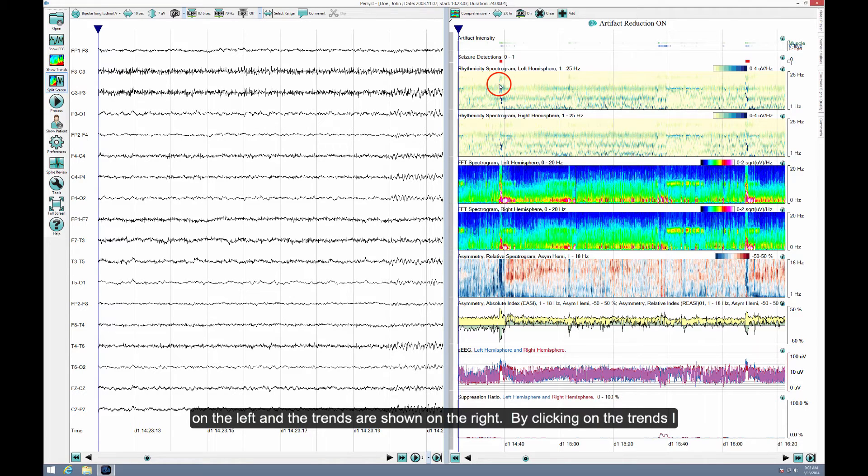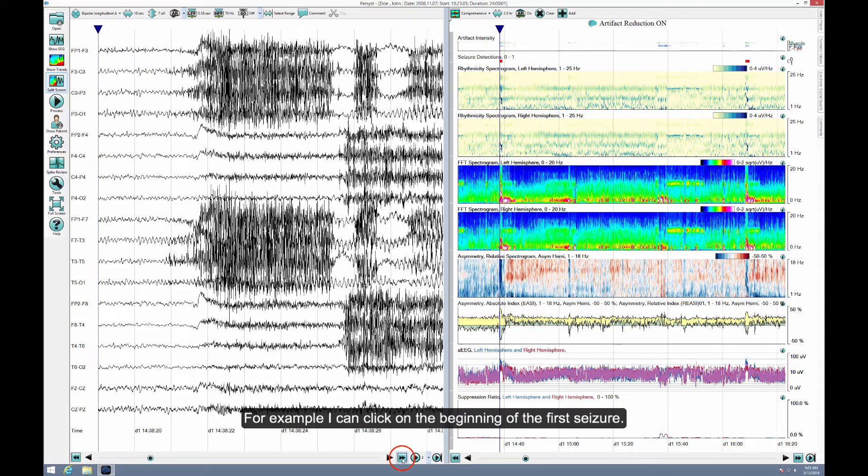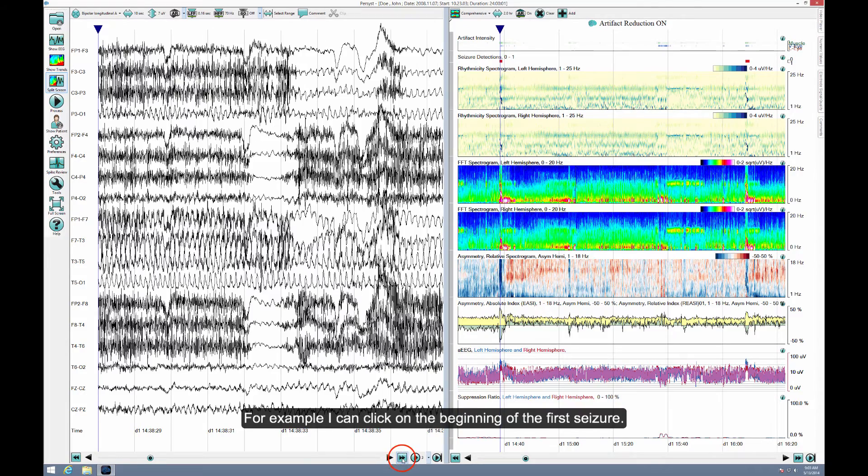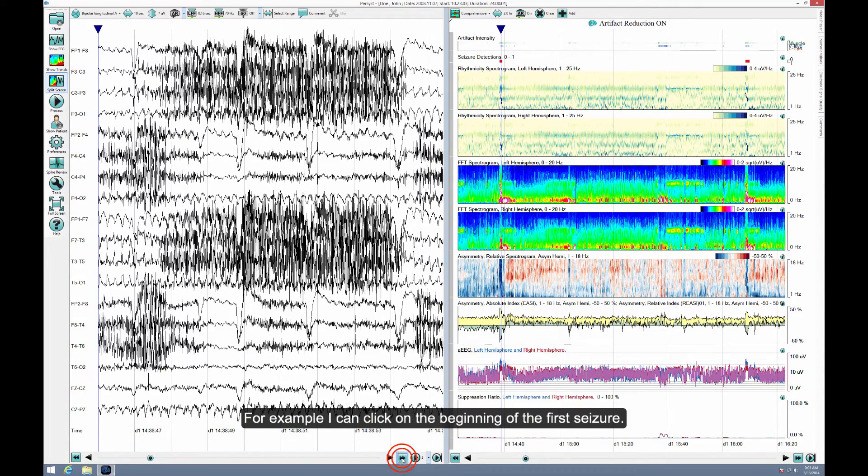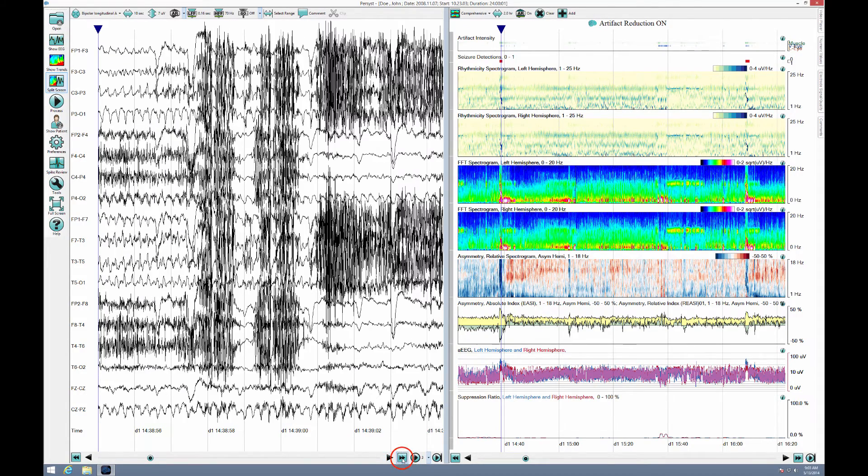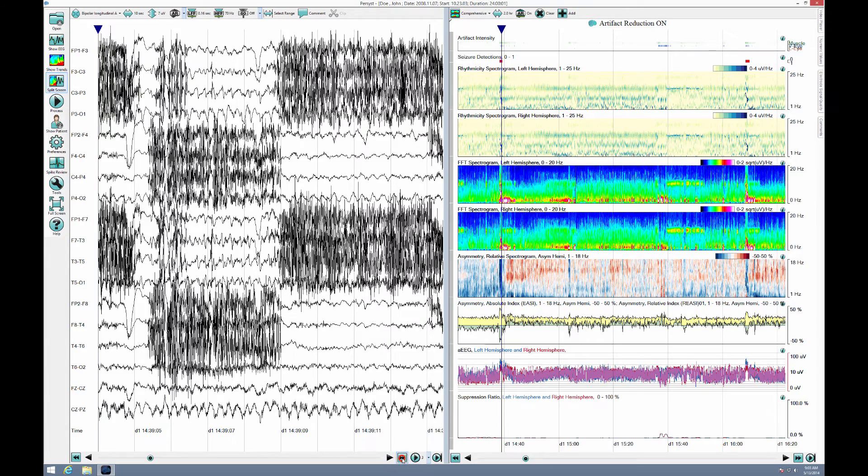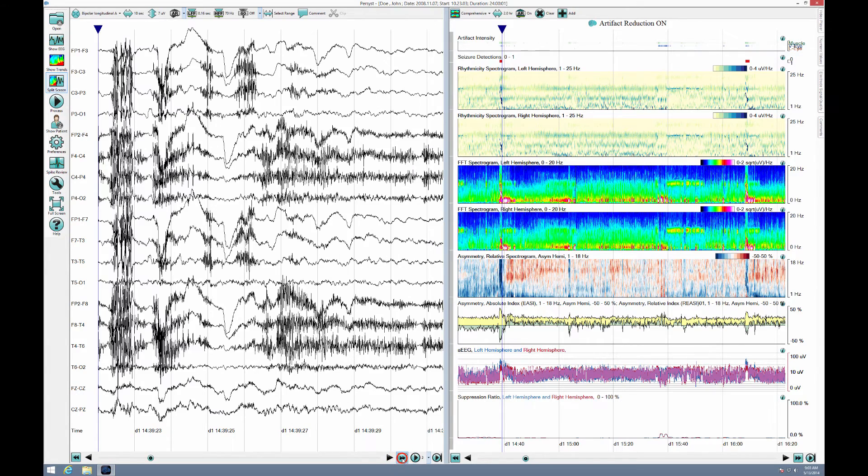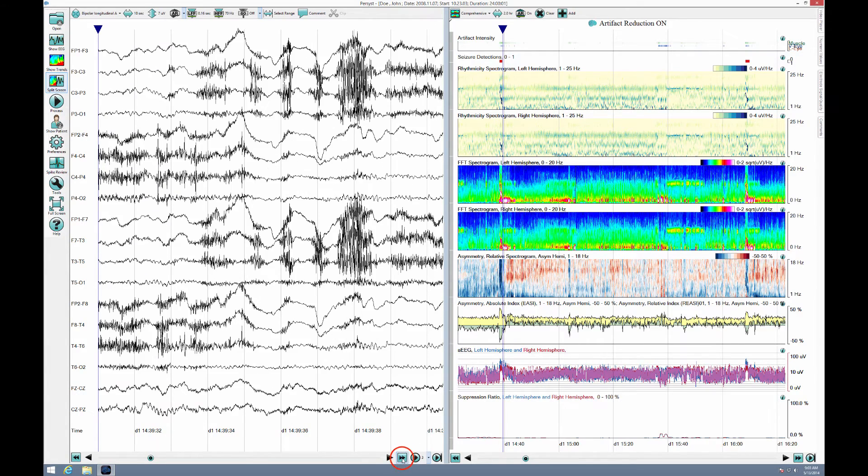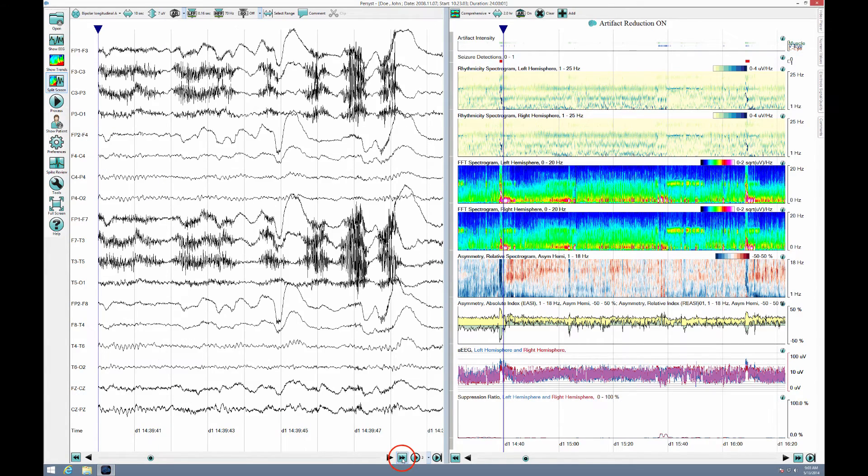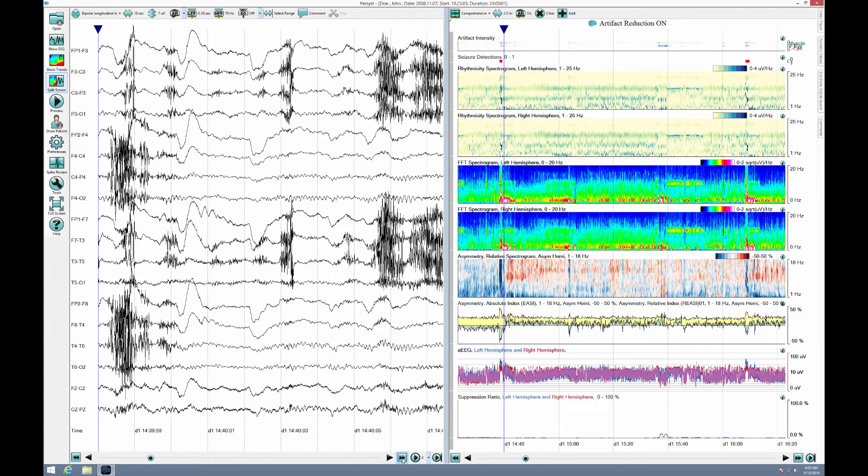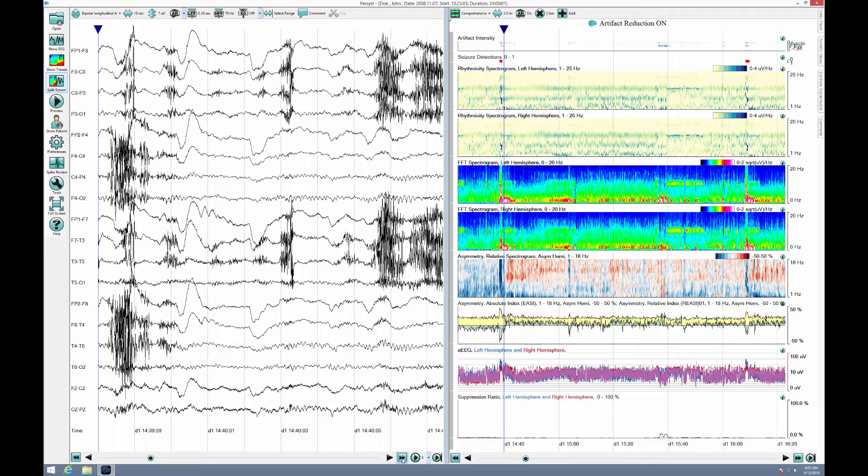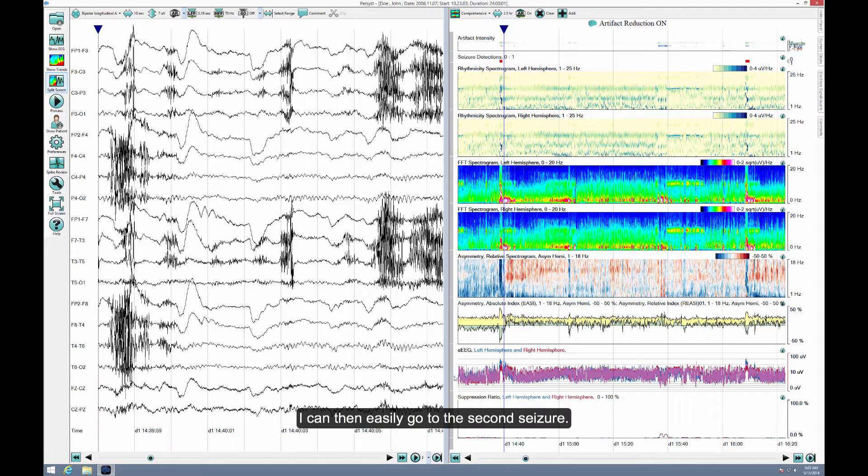By clicking on the trends, I can move the EEG to that portion of the record. For example, I can click on the beginning of the first seizure. I can then easily go to the second seizure.